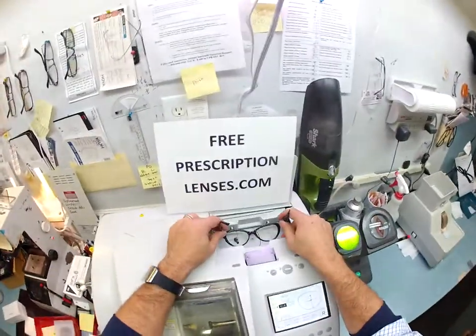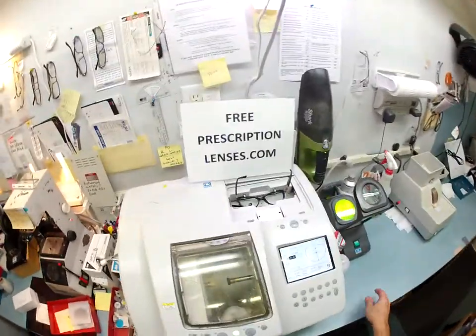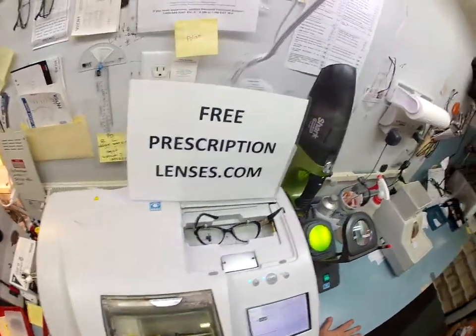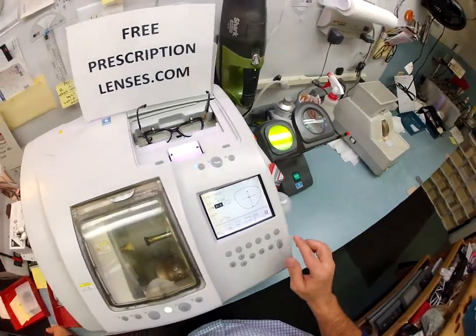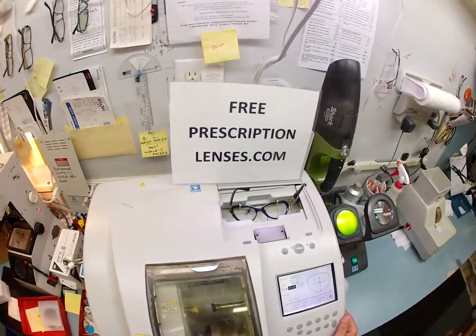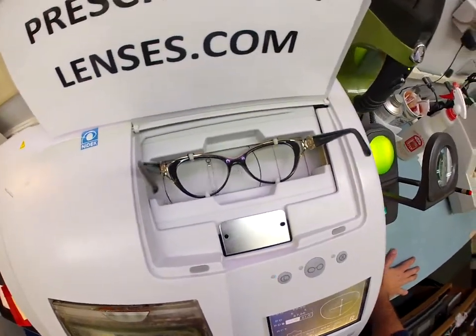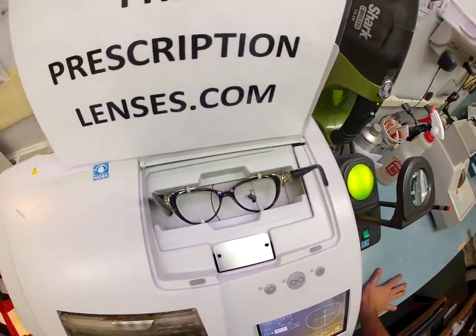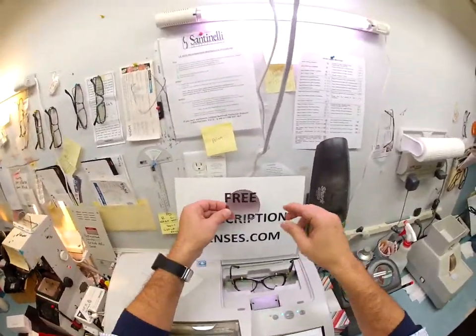I'll trace your Italian frame and — coincidentally — in my Italian edger, this is a Santinelli LE 1000, which will be cutting your Versace frame. The stylus is tracing your left lens and it is going to go over and trace your right lens, so I know what size and shape lens to cut.